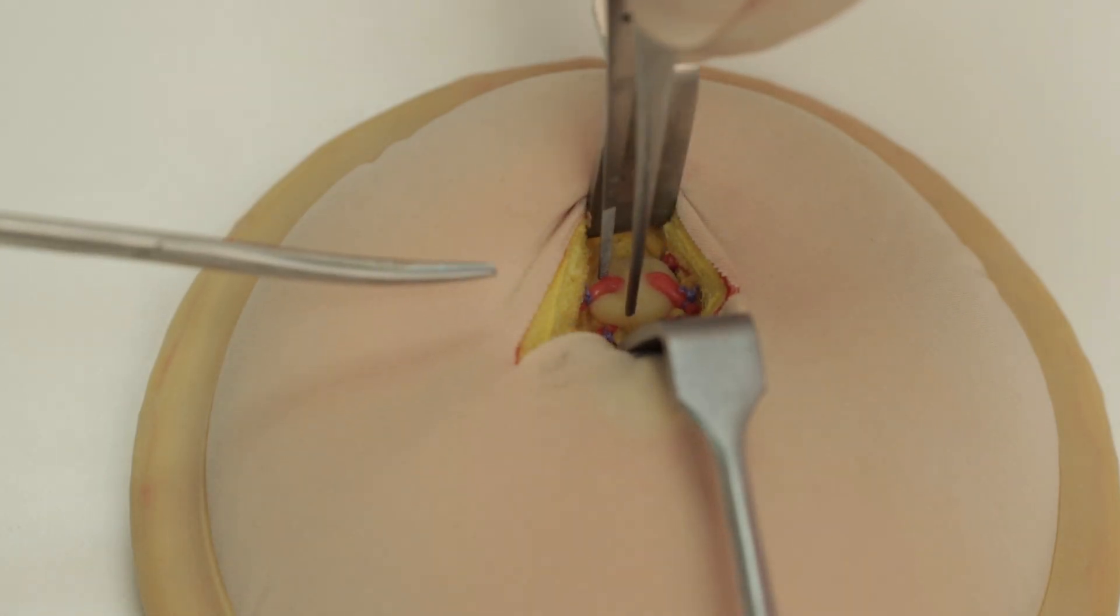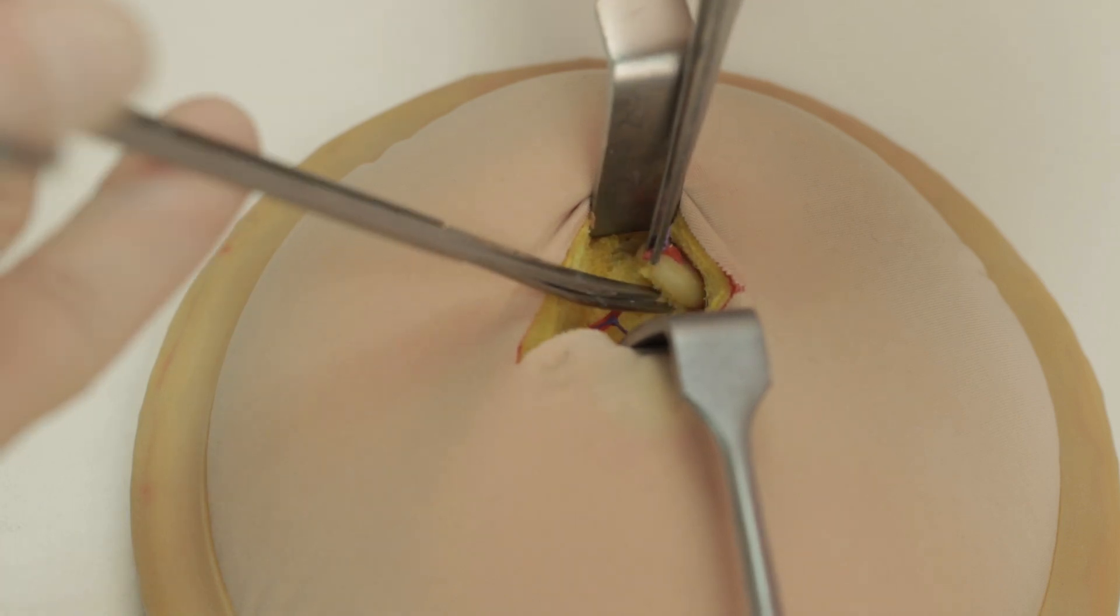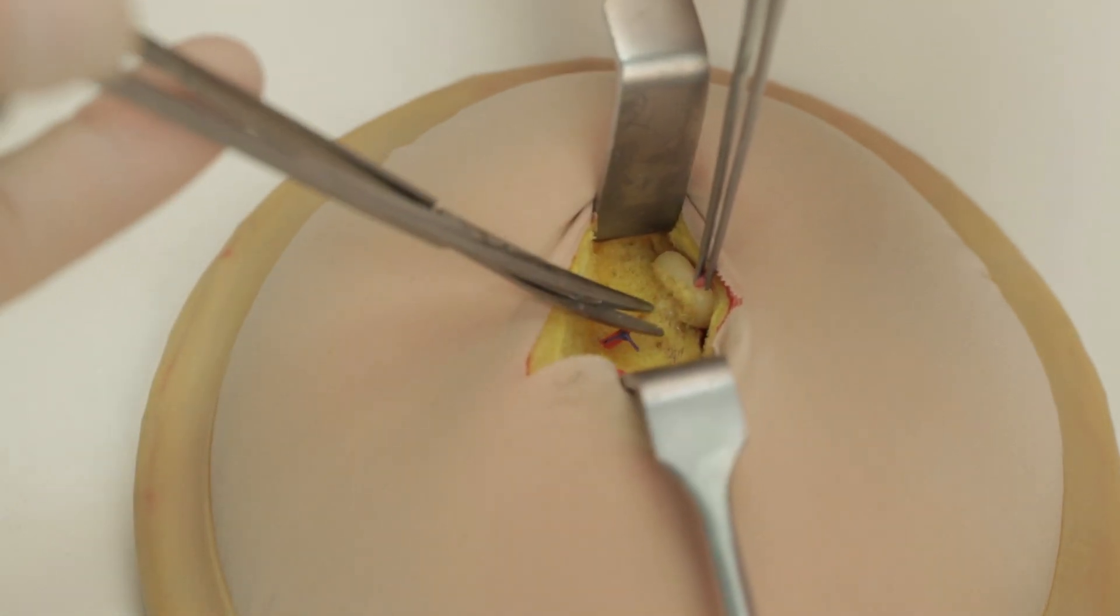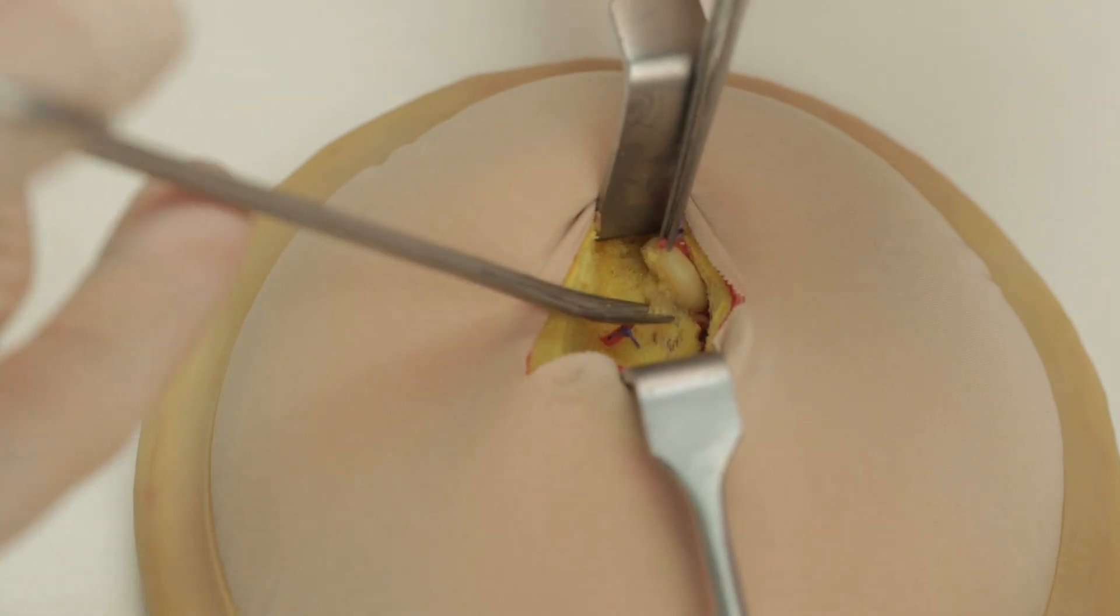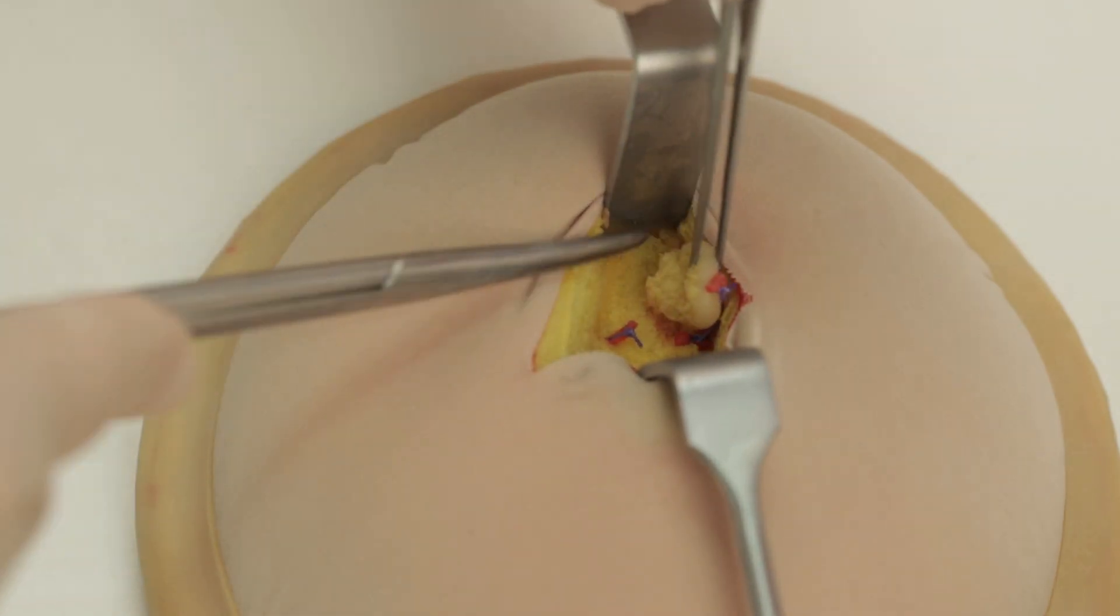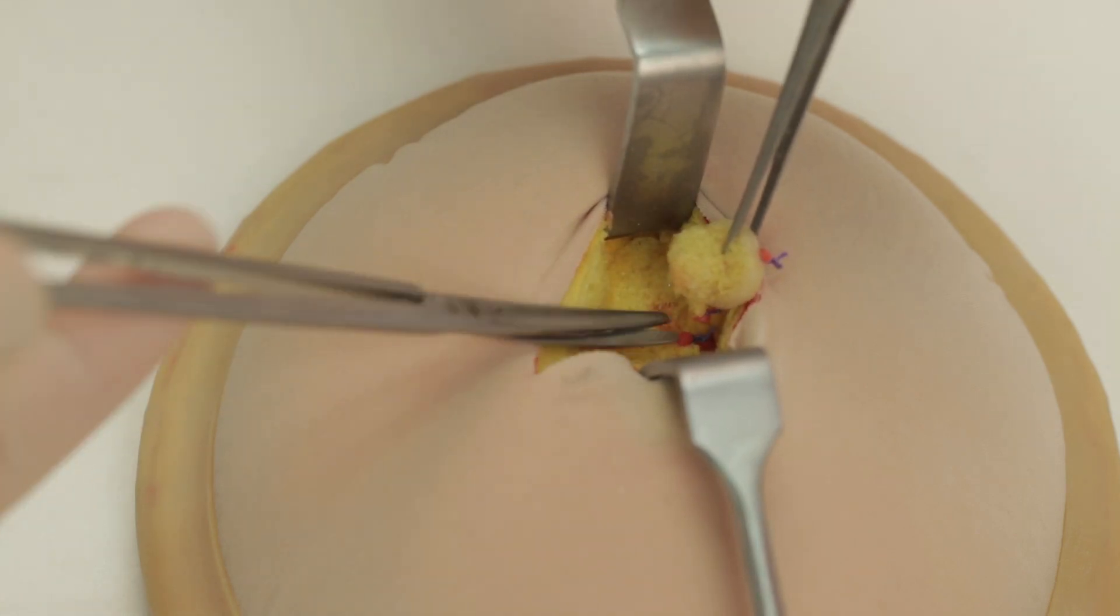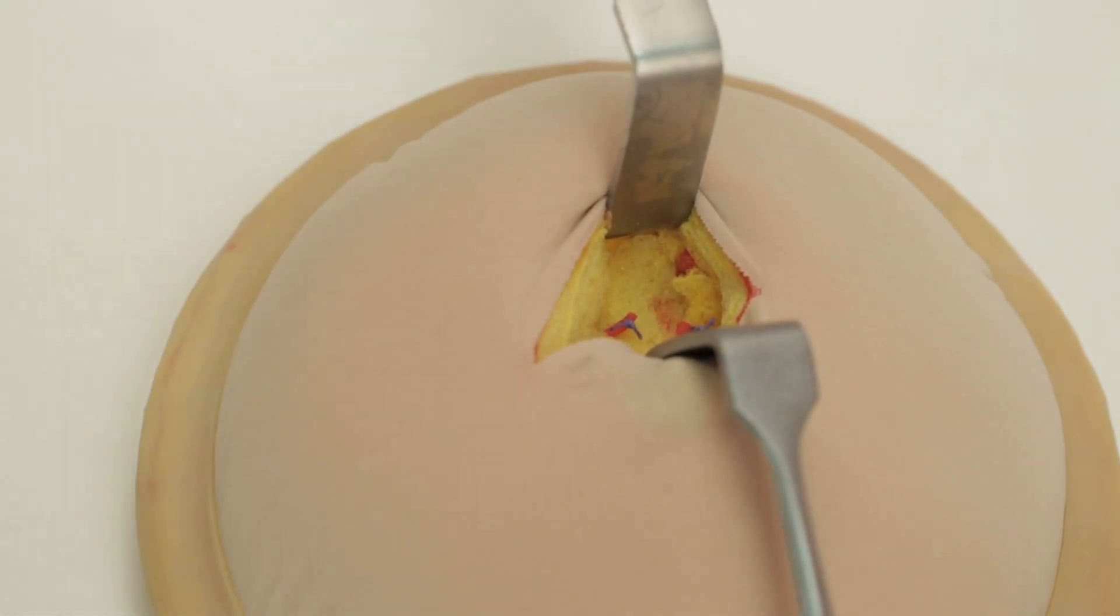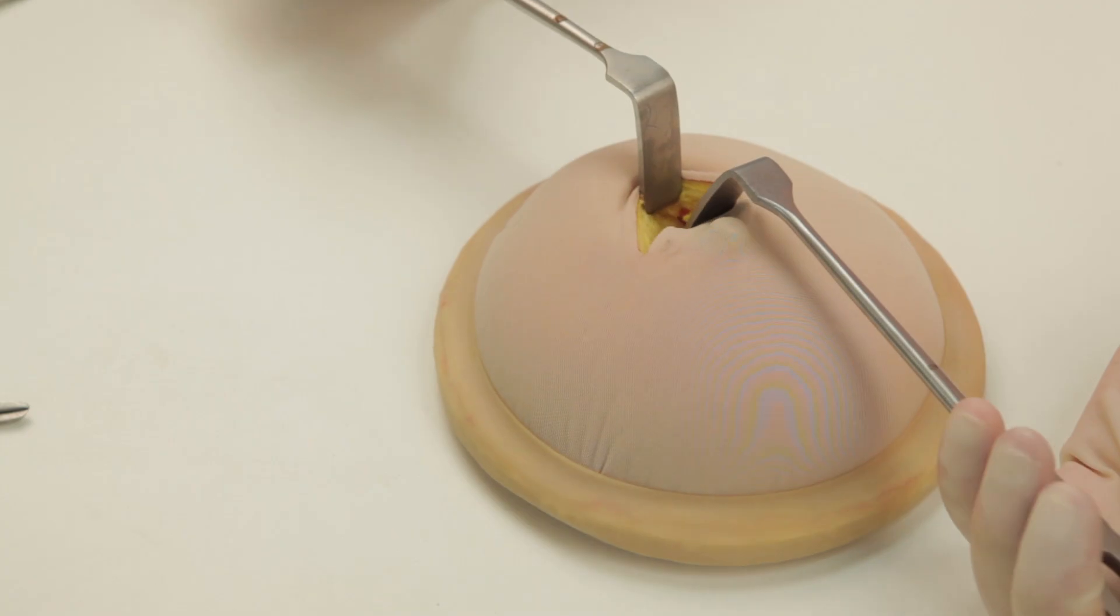It may be appropriate to grasp the lesion with forceps such as Alice forceps or Littlewood's forceps. Remove the lesion by freeing it from its posterior attachments. Remember that in reality, all lesions removed should be sent for histological analysis.